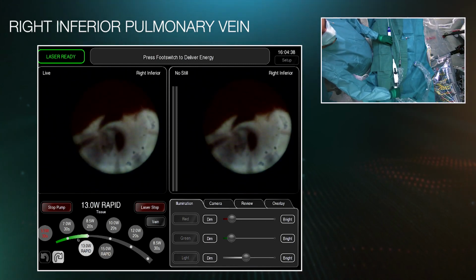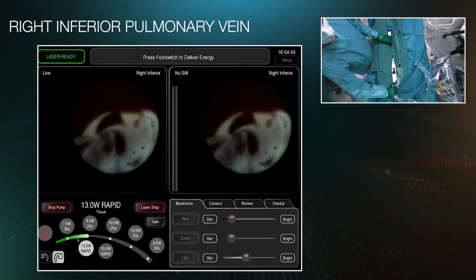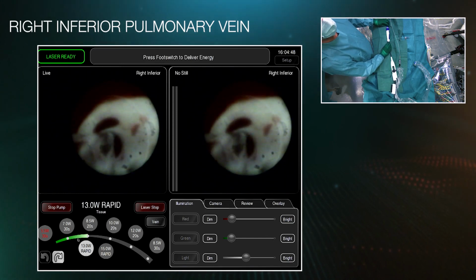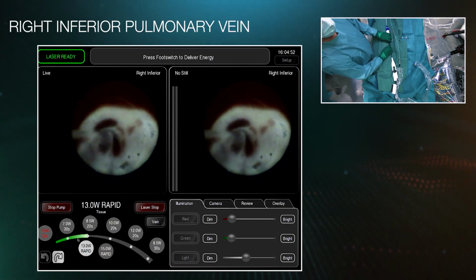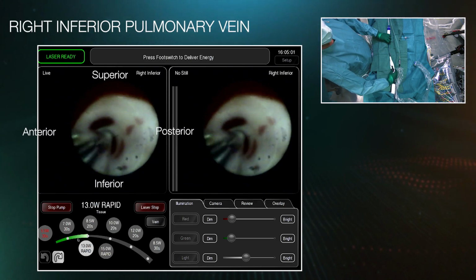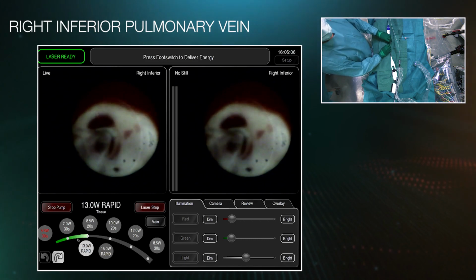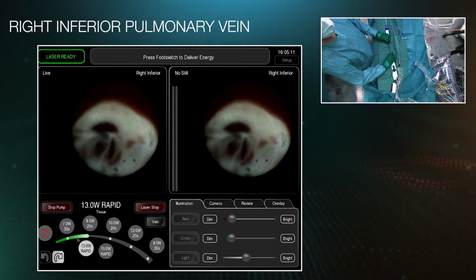Inflating the balloon. I can do this myself here with the little handle. And you see now I've increased the size of the balloon. I'm outside of the vein now, and I can advance, push a little bit to enhance the contact without overdoing it. And there. The fact that the balloon is compliant makes it easy, of course, to assume unnatural or unconventional shapes and still get good occlusion, even if anatomy is challenging you.